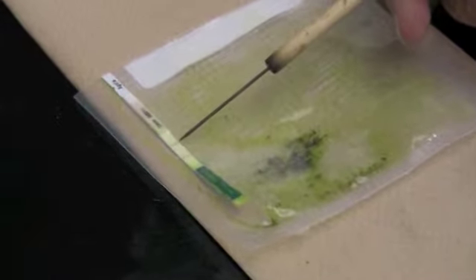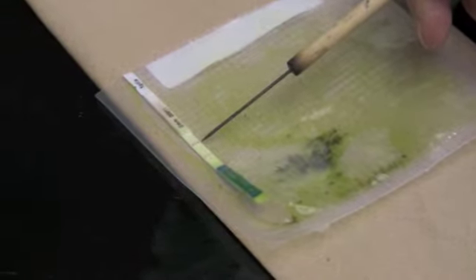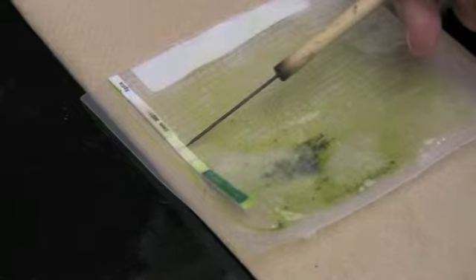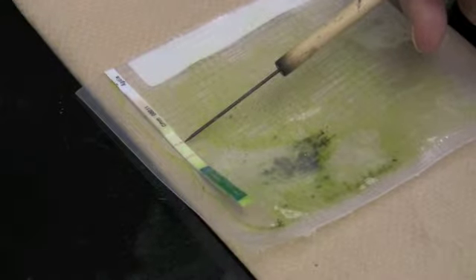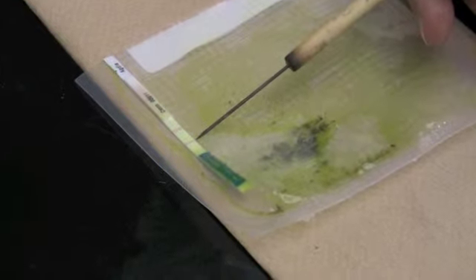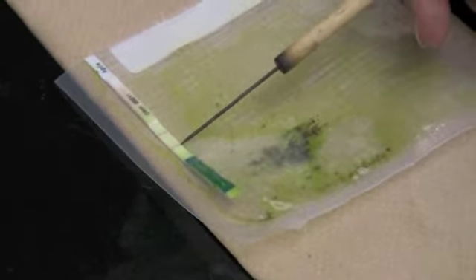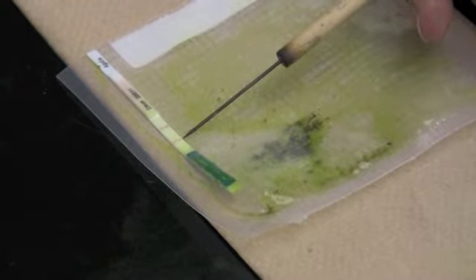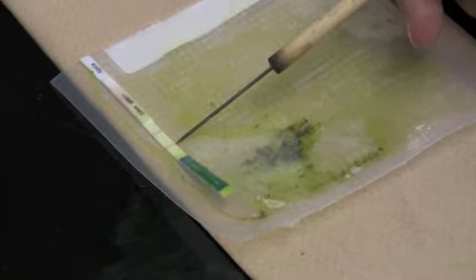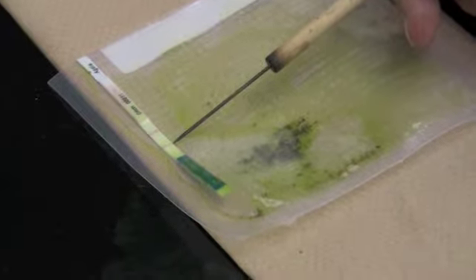We have one band which has turned a pinkish color, which indicates that this is the control. This tells us the test is working properly. But here is the reaction to the bacteria that were in the sample. And the fact that this reaction has occurred tells us that there is evidence for the presence of bacterial canker in that tomato sample that we looked at.